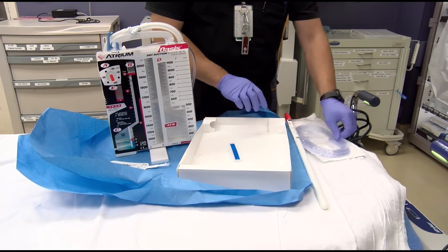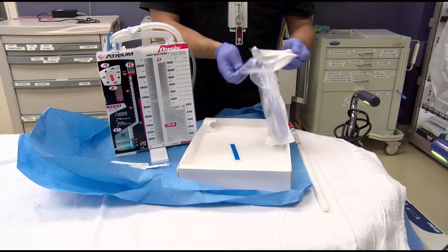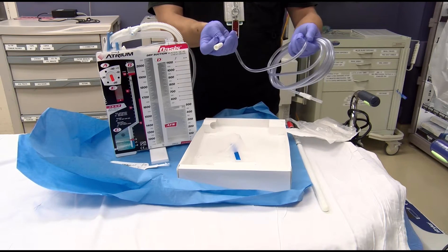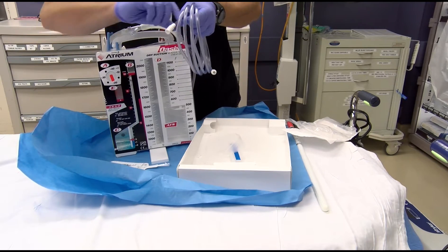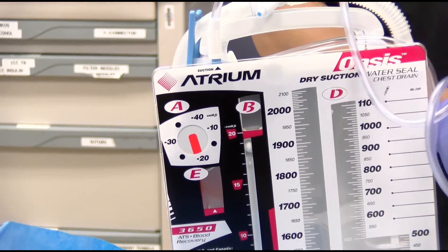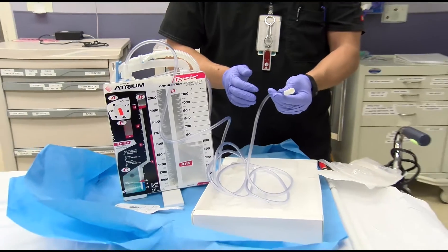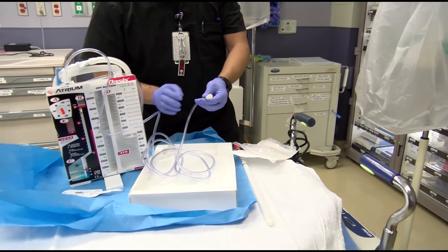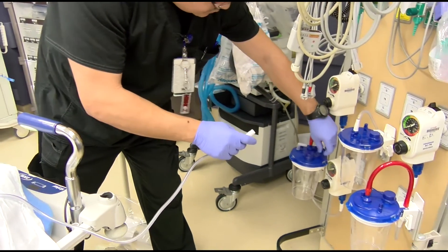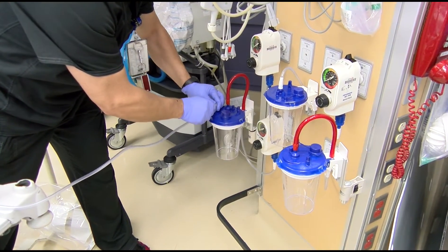Attach the suction tubing — one end goes into the suction port on the drainage unit where it says suction, making sure you have a nice tight seal. The other end goes into the suction canister set at about 60 millimeters of mercury continuous suction.